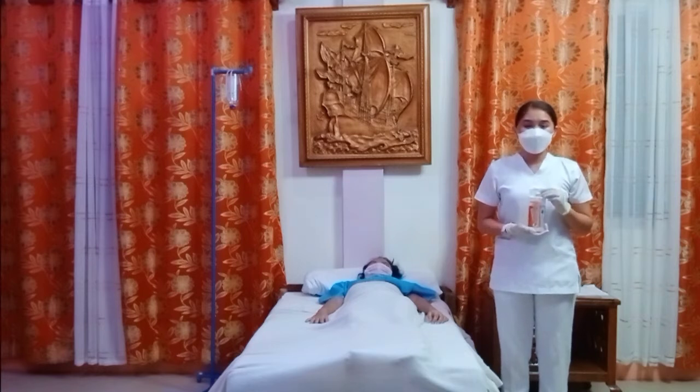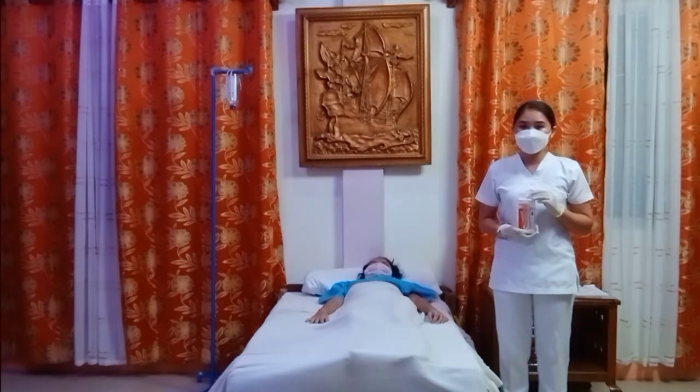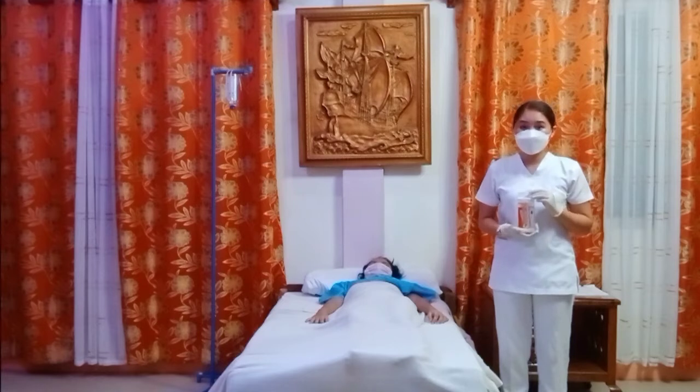As for the rectal temperature taking, apply clean gloves and instruct the client to take slow and deep breaths and insert 3.5 centimeters in adults. Gentle insertion will decrease discomfort to the client and will prevent trauma to the mucous membrane, which eases the insertion of the thermometer.